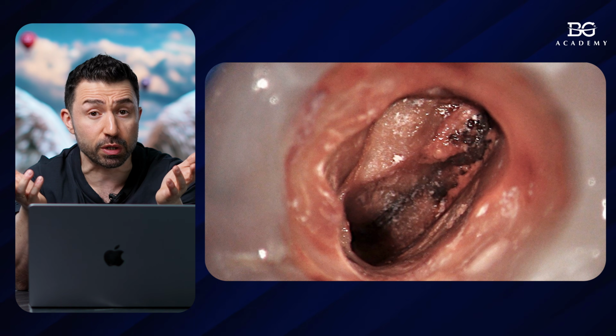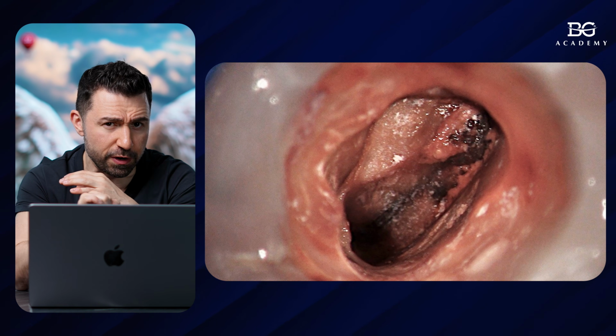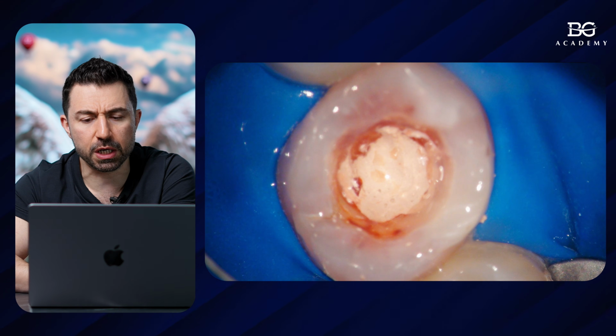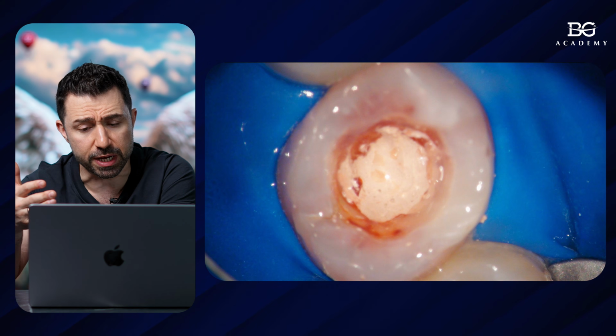The first thing is a sandblaster, okay? Sandblaster, aluminum oxide, 27 microns, 5 seconds, everything will become super clean. Or like in such a case, I would like to show you what I performed. So those are the steps of the access cavity formation.